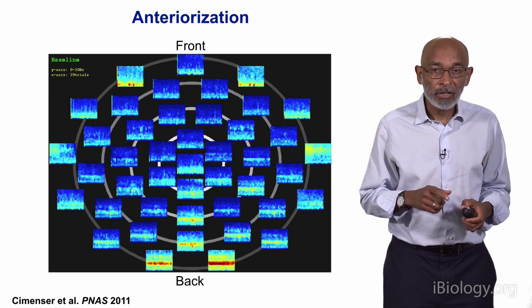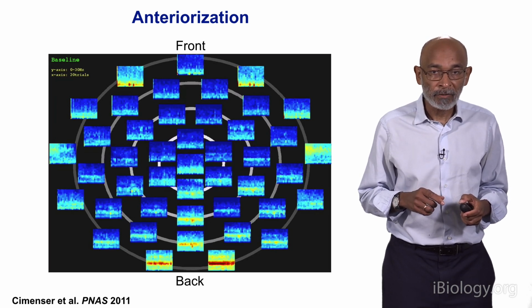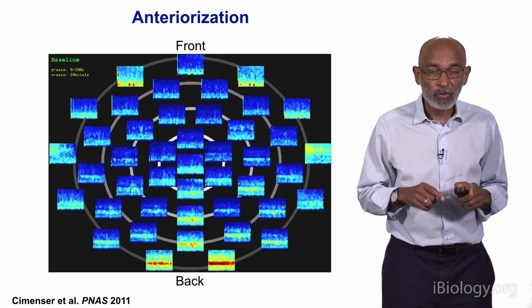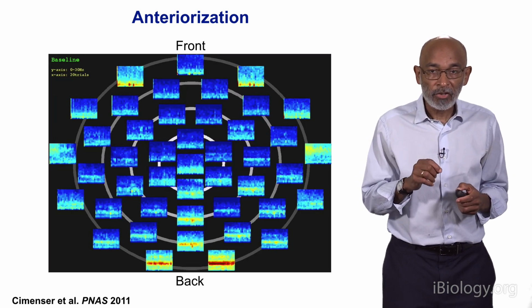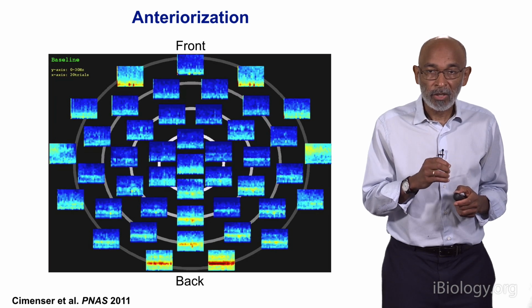So what I've done here is I have a volunteer subject who's lying there with his eyes closed. And each of those sites, there were 64 in all, I'm only showing you 44 of them, is a location where I'm computing the spectrogram, like I just talked about in the previous slide, so I can show you what the oscillations are like across his head.